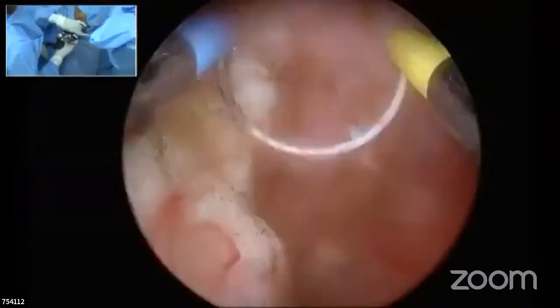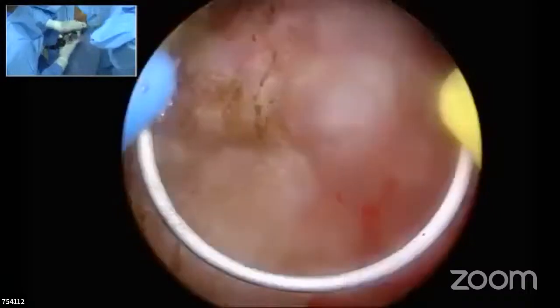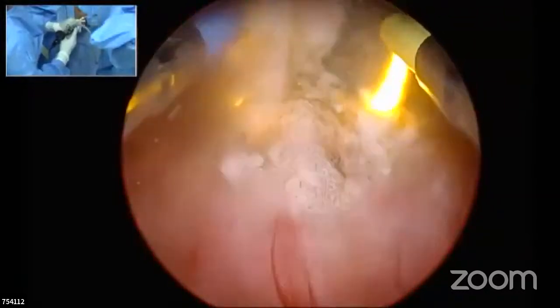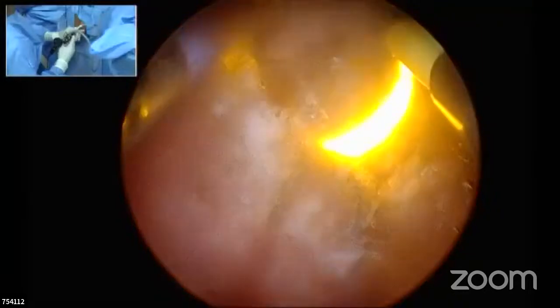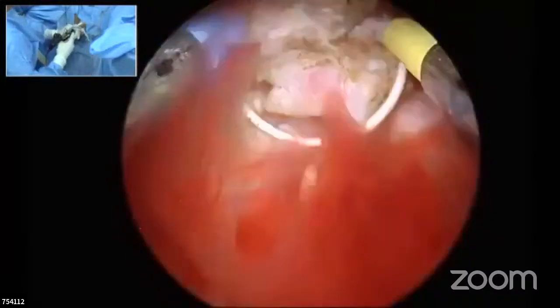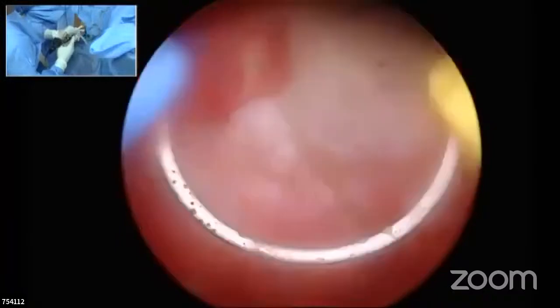Once you have reached there, I don't think it makes much difference. You know where it is. By seeing it, you can tell whether you have reached that area or not. But for people who are beginning, I think that's a better way to have better control and go slow. Going slow, you may take a little more time to resect, but it gives a fair amount of safety for your surgical intervention.